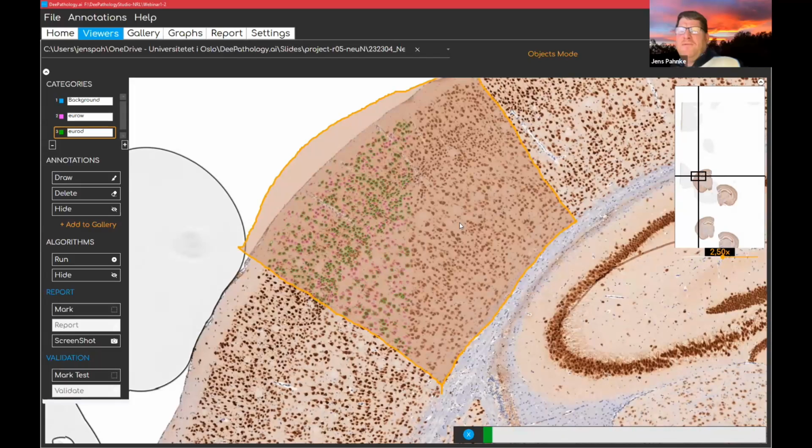I always prefer it if I see something that is not fully prepared. If somebody presents this to me in the lab, I'm always very happy if I can take part in a little bit of a discovery. So like here, you see it takes a bit of time, but what did we do? We had a 1 hour seminar detecting plaques quite perfectly. I would wait a little bit more for the teaching of the plaques, just for security reasons.